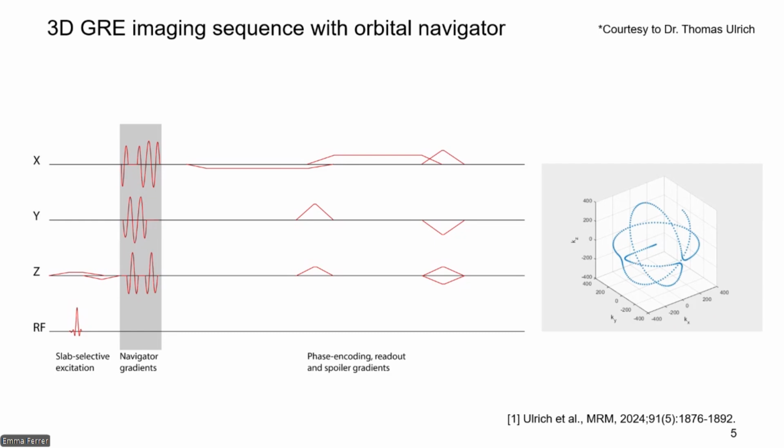This is quite good to capture rigid motion for several reasons. Actually, the method I'm going to present on the next slide also works for other trajectories, just as a side remark, like spheres, helices, and so on. But we find this one quite good.